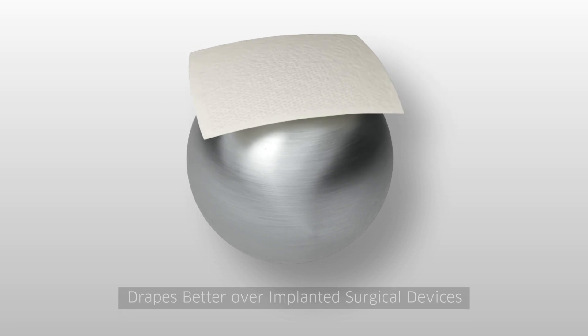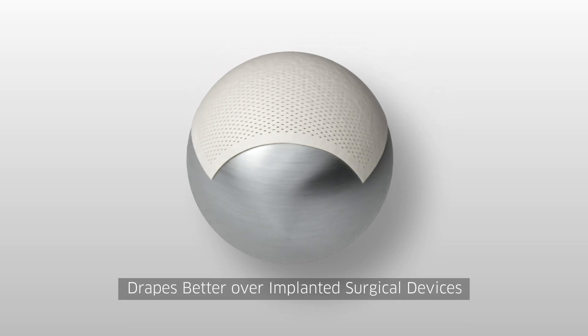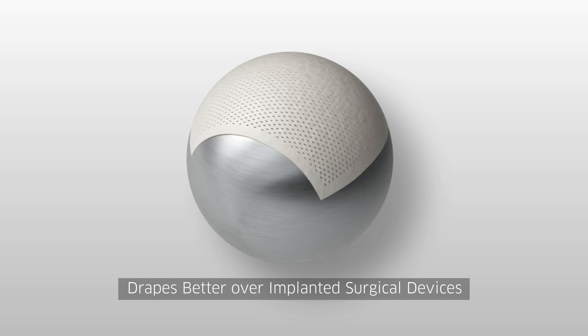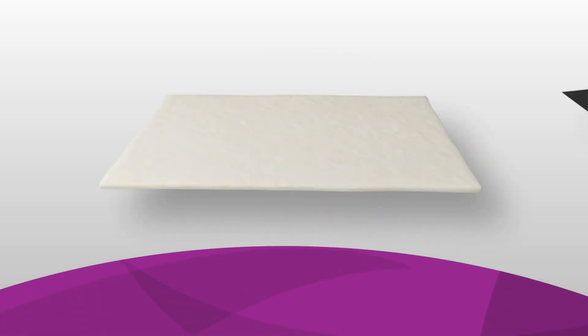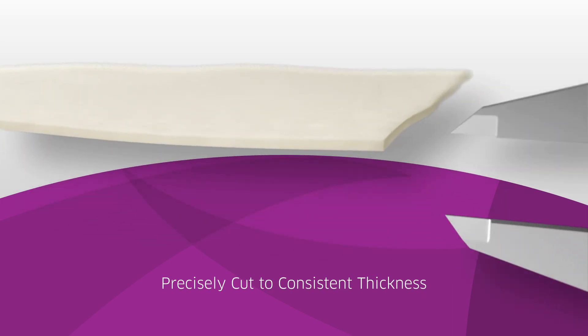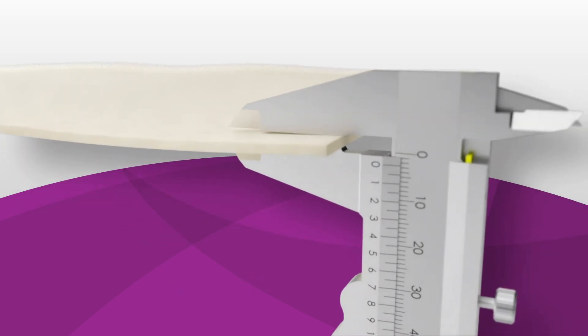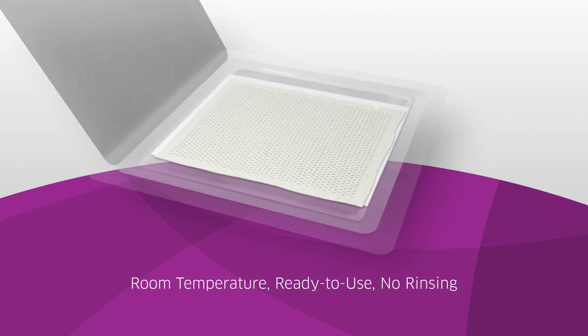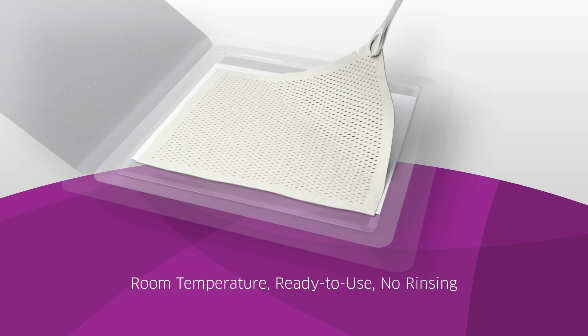The meshing pattern also allows the ADM to better drape over contours of implanted surgical devices, minimizing wrinkling that may hinder AlloGraft incorporation. AlloMend is precisely cut to ensure consistency throughout each AlloGraft as well as from piece to piece.